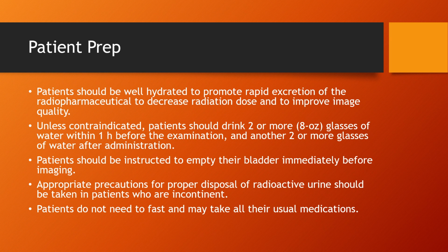Patients should be instructed to empty their bladder frequently and especially immediately before imaging. Appropriate precautions for proper disposal of radioactive urine should be taken in patients who are incontinent. That's really important. If the patient is incontinent, you want to put lots of chucks down on the table underneath them. That way, if they do have an accident on the table, it won't contaminate your table. You can just clean up the chucks. Patients do not need to fast, like I said, and they can take all their medications as usual.